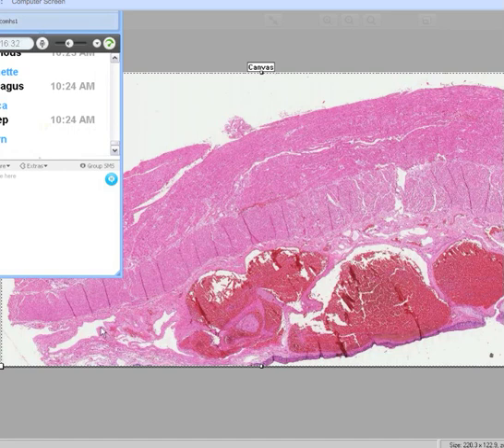Now, the first thing that you're noticing is that the esophagus should have a squamous mucosa, and then it should have some little vascular tissue, looser tissue in the submucosa, and then you got muscle here. But which of the 4 layers of the GI tract is the abnormality in? Mucosa, submucosa, muscularis, or adventitia?